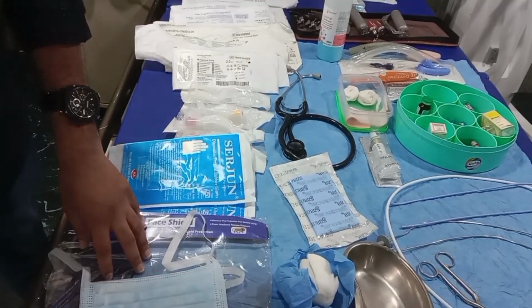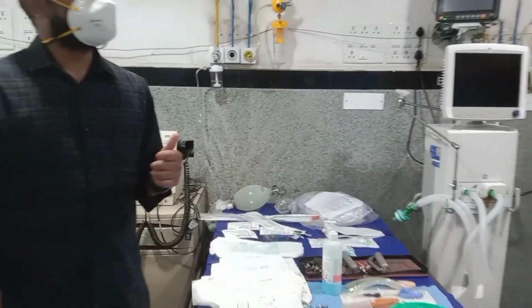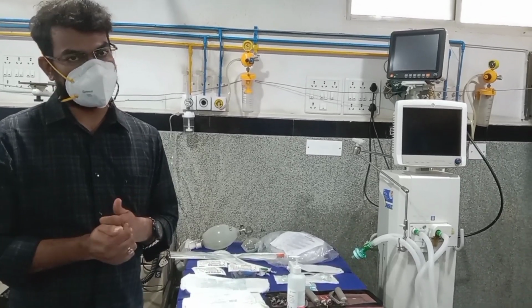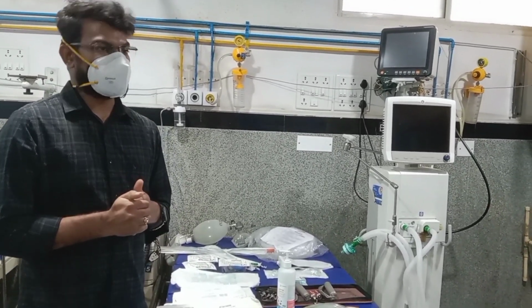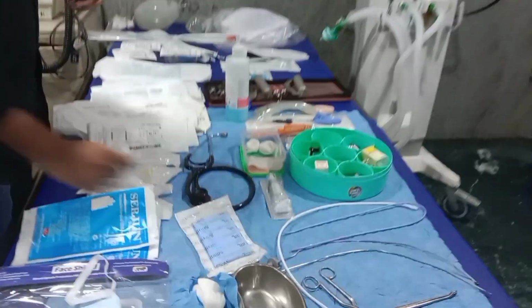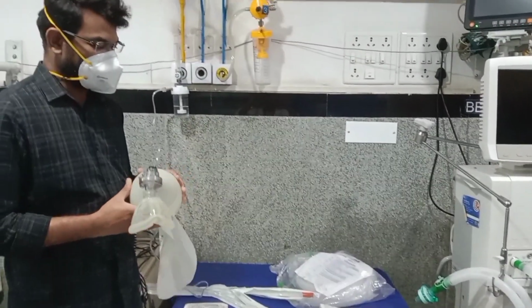So after preparing this, we should prepare the patient. Before doing intubation, we should make sure that the patient is connected to a cardiac monitor, and we should monitor his vitals prior to intubation. The main things we have to check are the bougie, laryngoscope, and ambu.